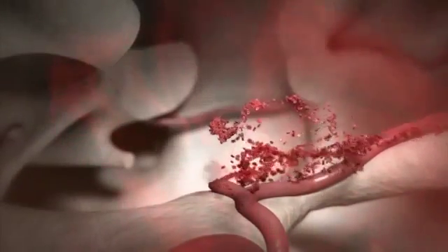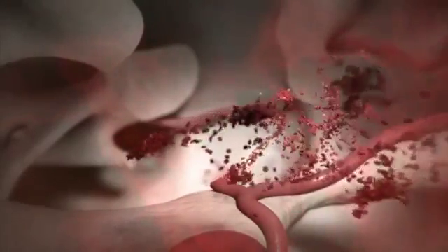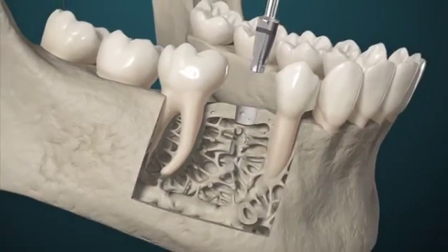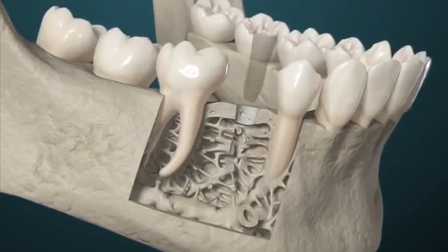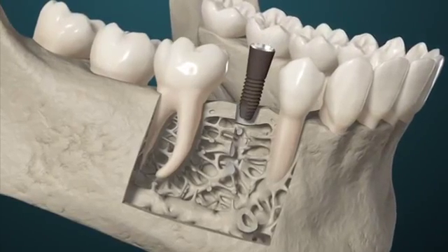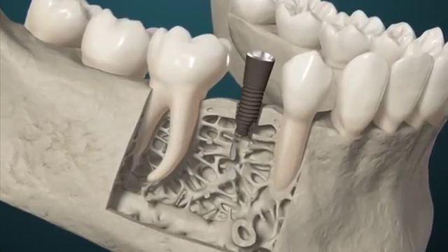A drill intrudes and destroys the naturally sculpted bone. Blood vessels are torn and a major defect is created, quickly filling with blood. The titanium implant is inserted where the tooth was previously lost. At first, the only force holding the implant in place is mechanical friction. This is called primary implant stability.